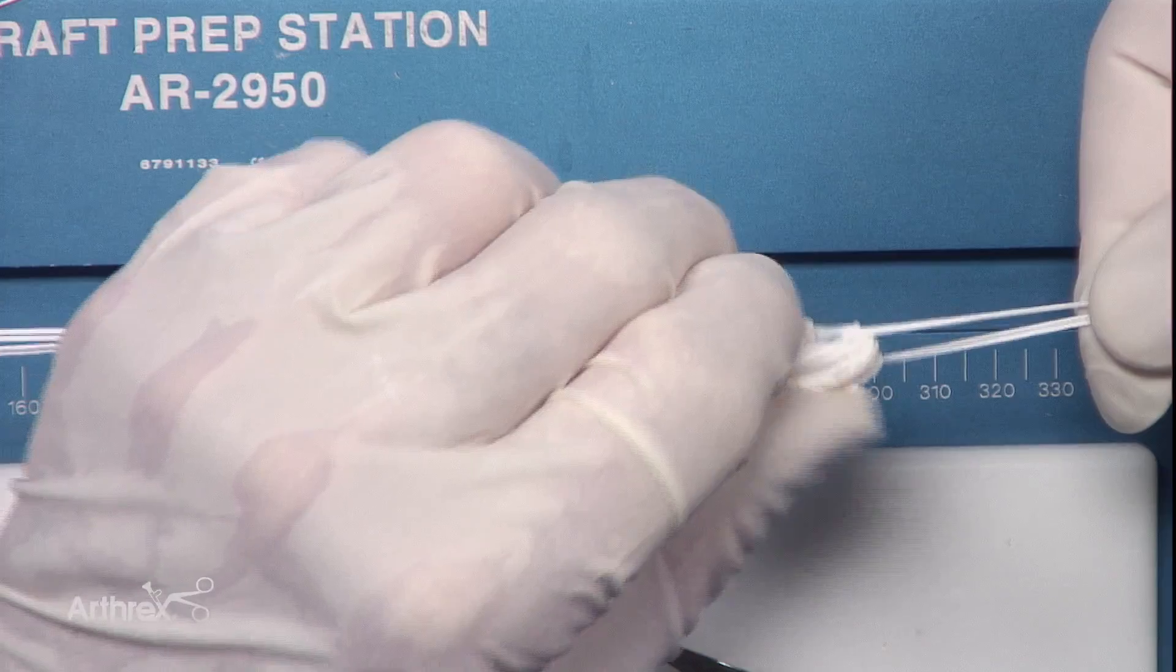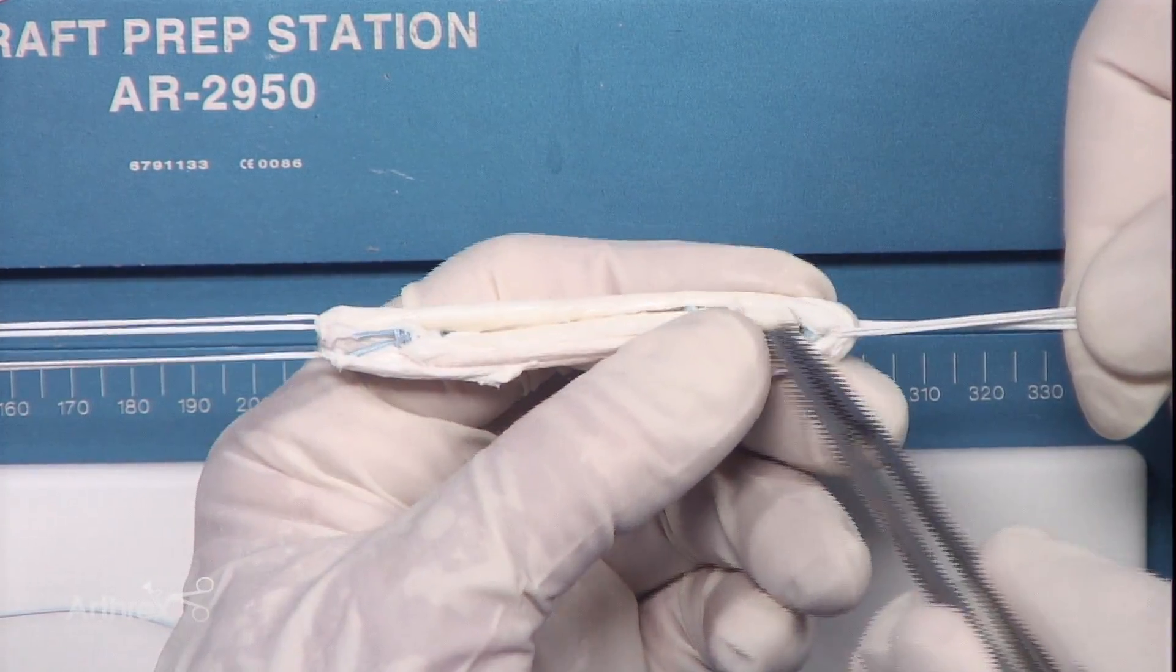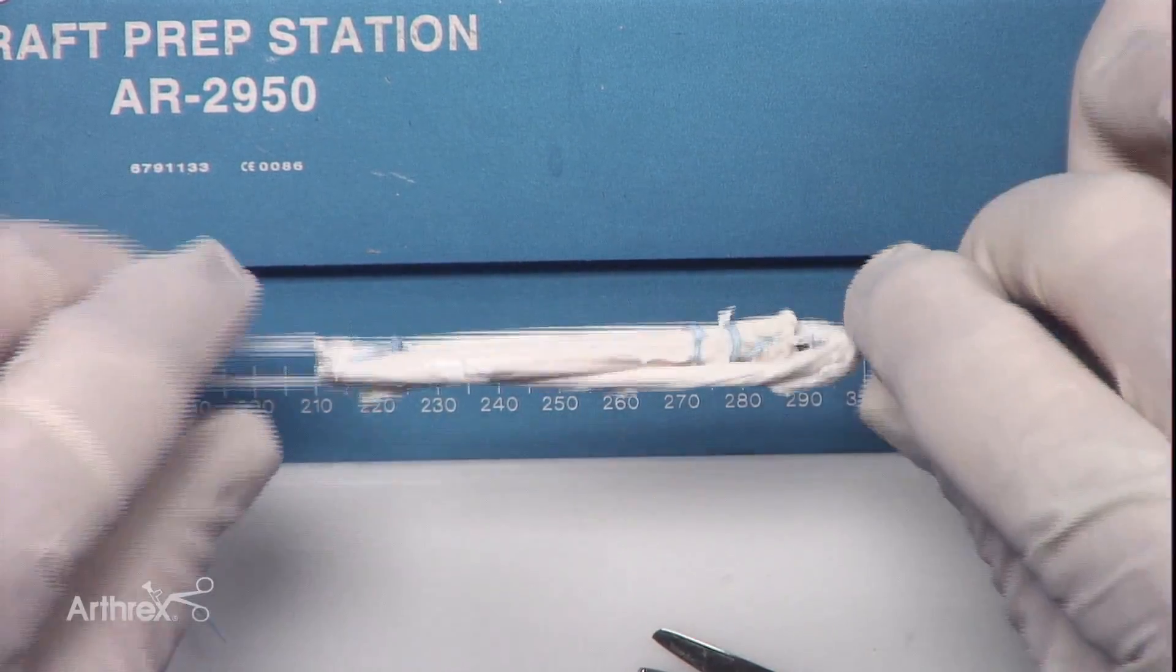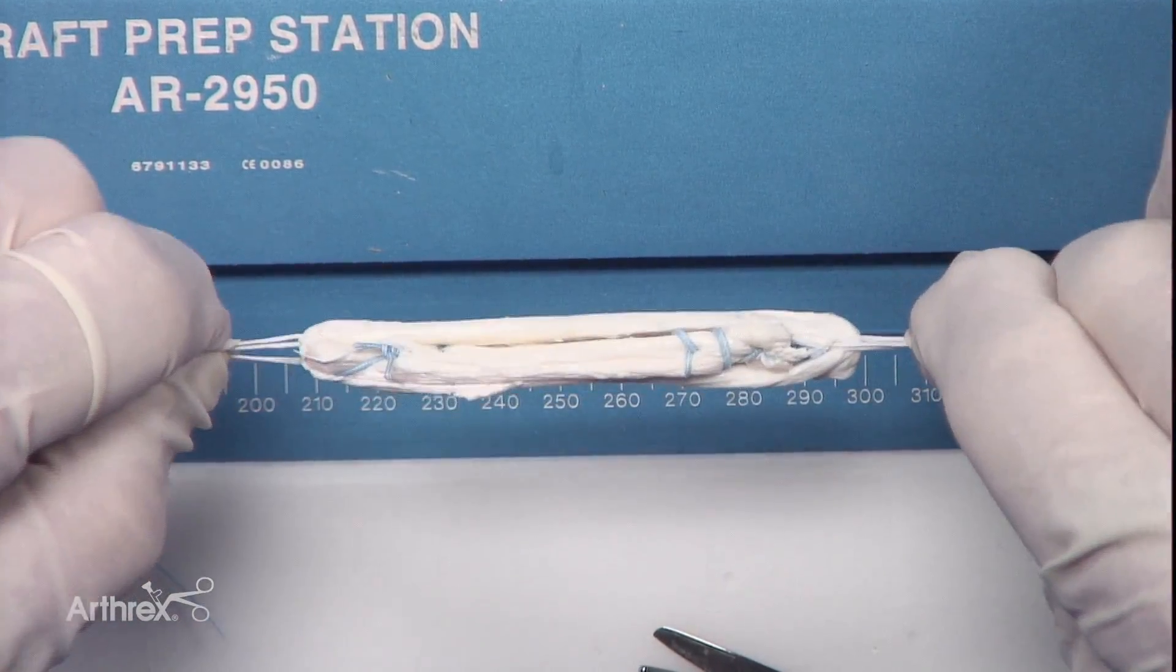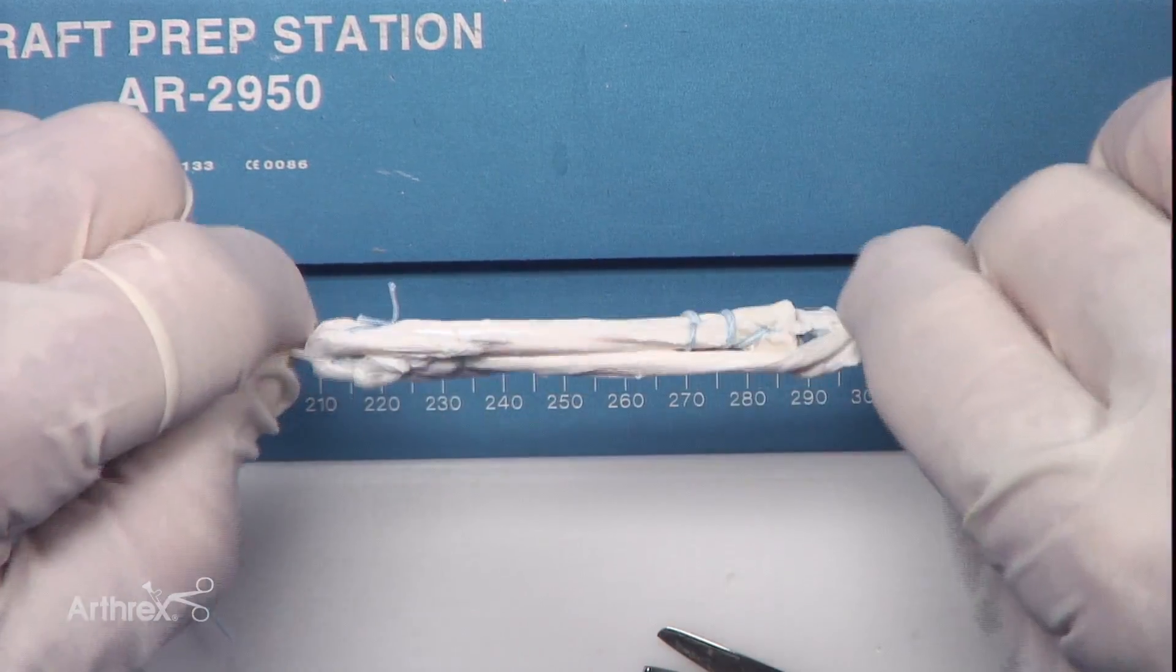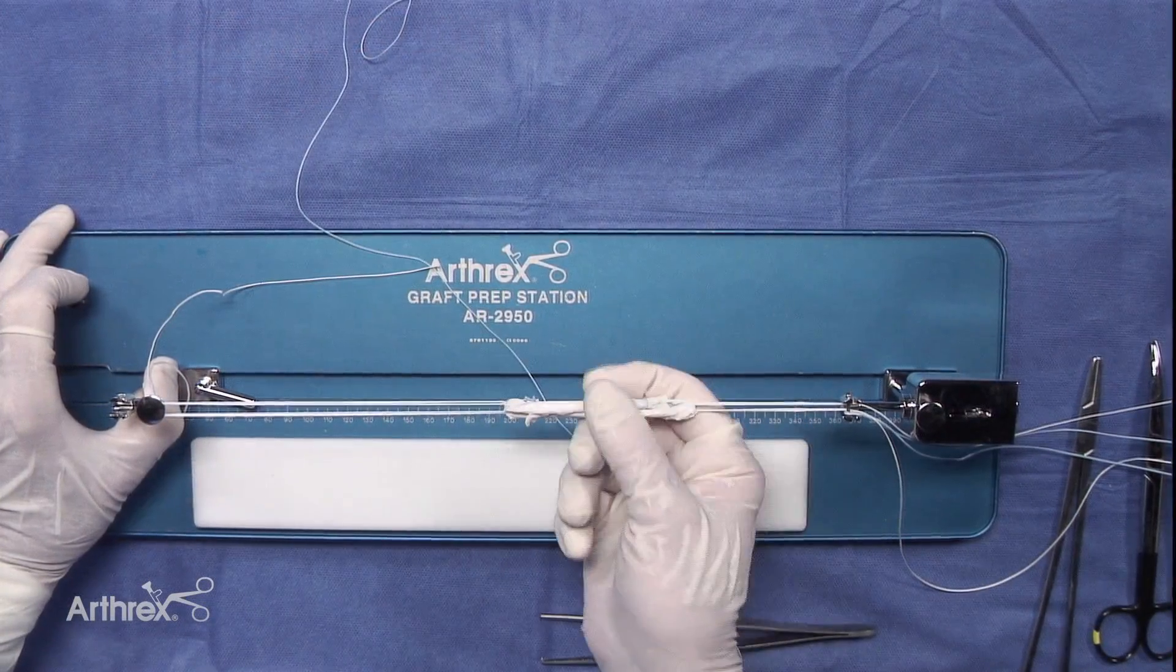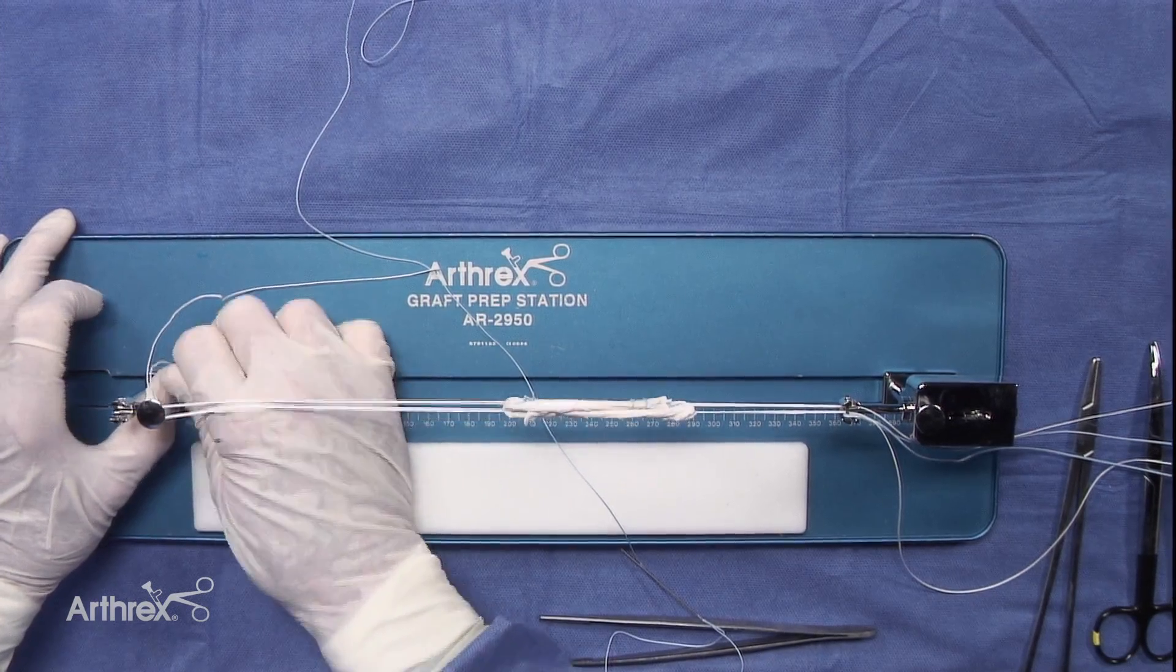If we look at our construct, then we have this graft right up to the tip here. We have it looped around, and the end is here. It's obvious at this point that we don't have very much graft strength. So we now have to add the final suture, which is a number two fiber wire. We'd like to put our graft under tension when we start suturing it. I have about 25 newtons on it. We're eventually going to go to 40 newtons.